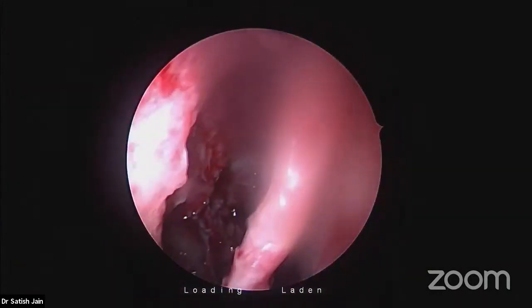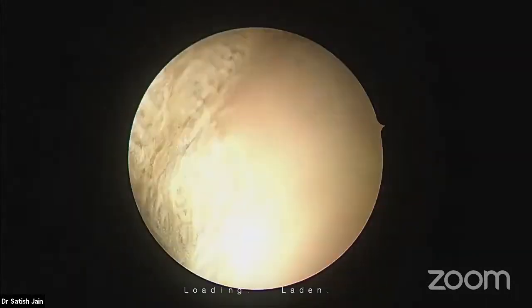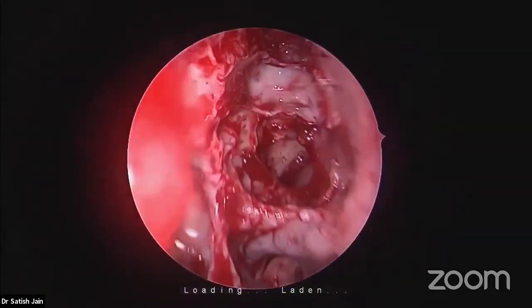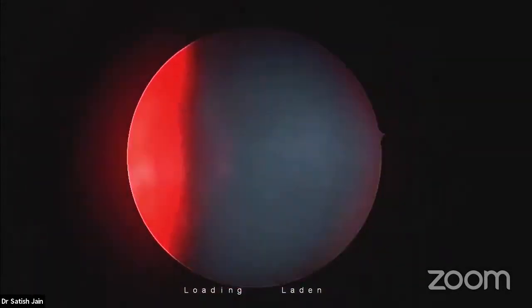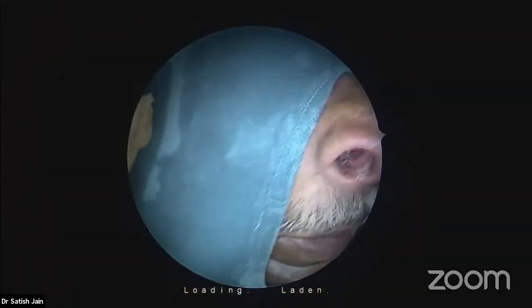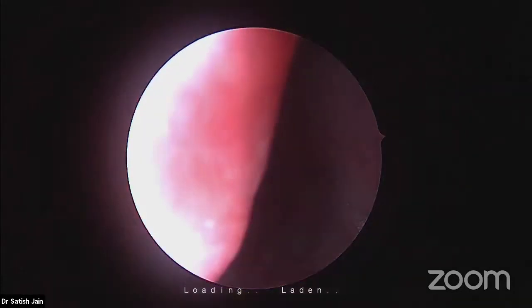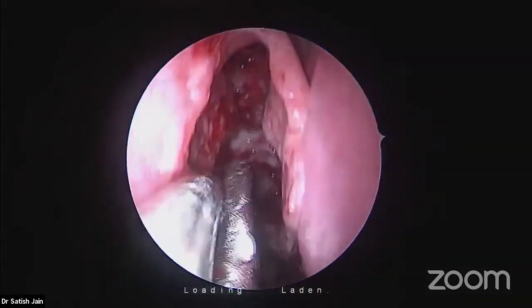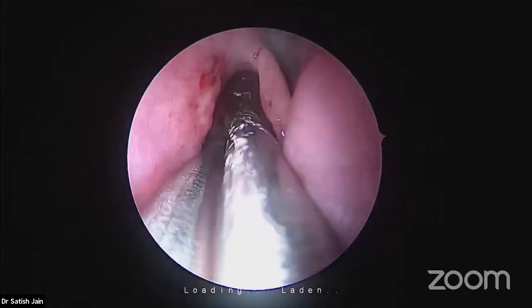It is very, very shallow. I can tell you the location. That is supraorbital cell. And this is the middle turbinate. See how nicely it is lying close to the septum. The best treatment of the middle turbinate is not to disturb it. And if you happen to damage it, you may have to do a partial resection or something like that, Bolgerization.